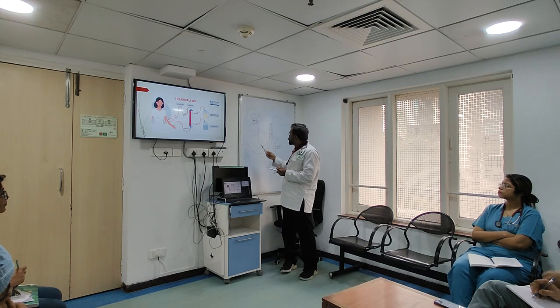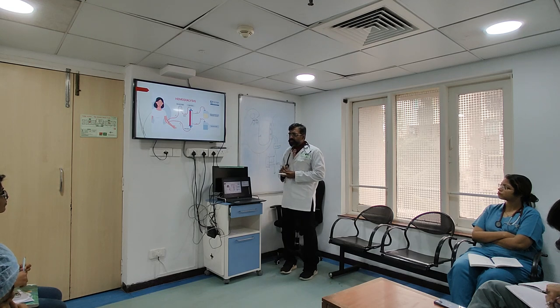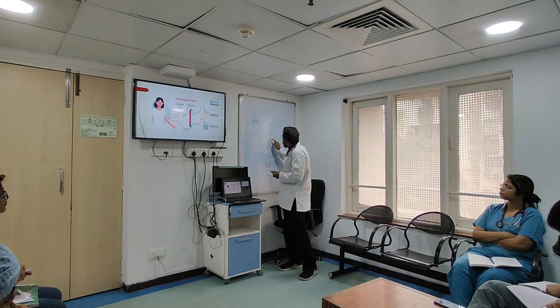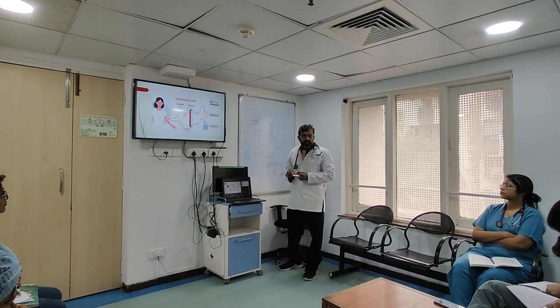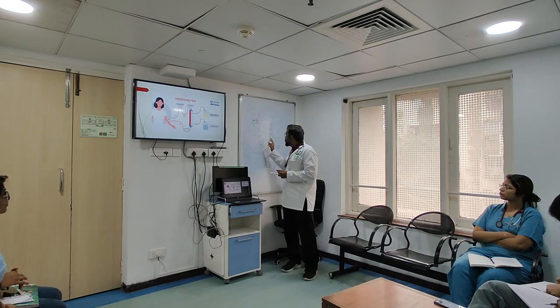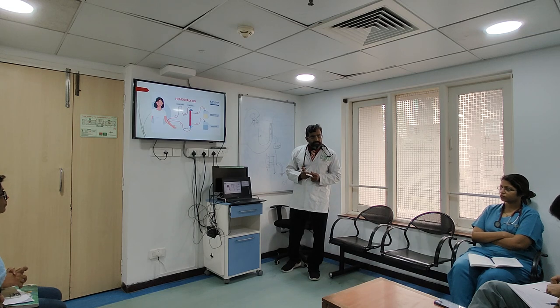Similarly, when it pushes ahead, there is another pressure here, which comes in over here. That's the post-pump pressure. It will tell whether there's a problem here. So by looking at these pressures, you have an idea of whether the problem is here or the problem is there. Is it making sense?